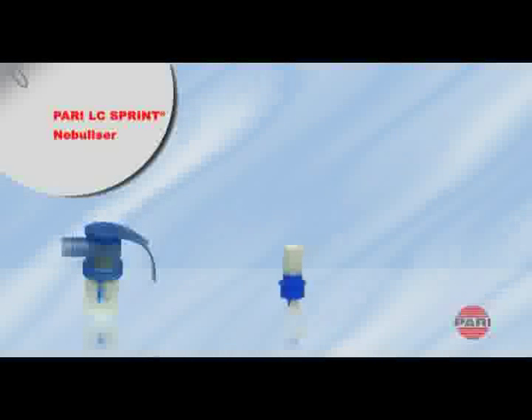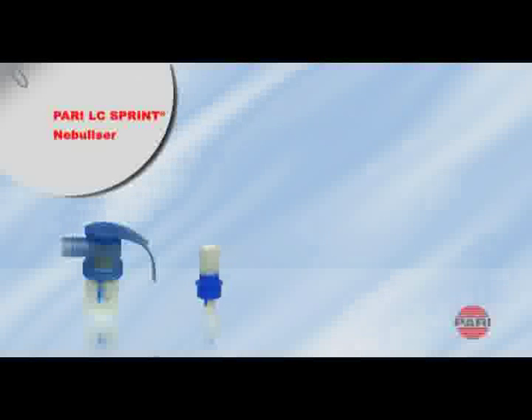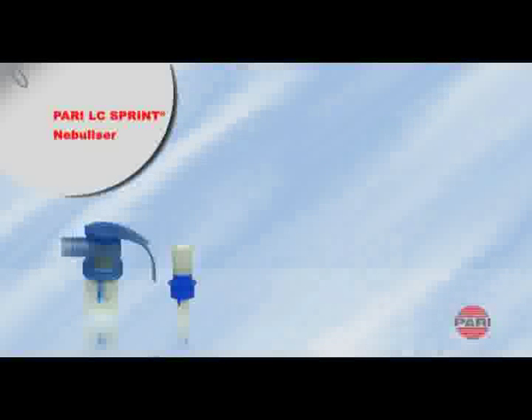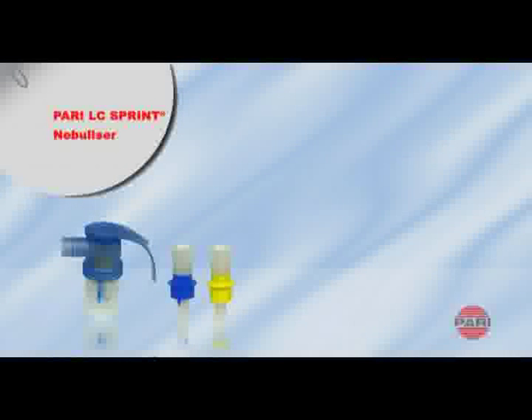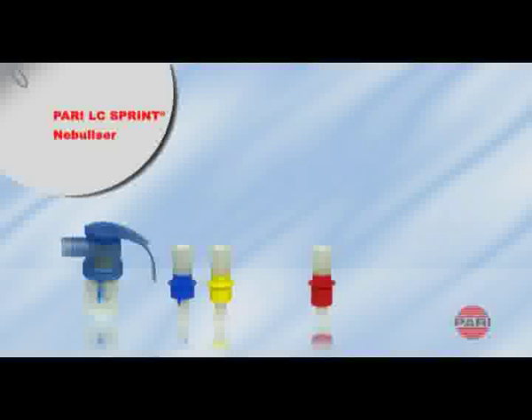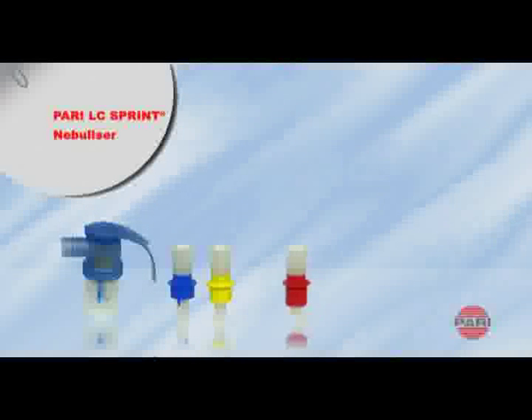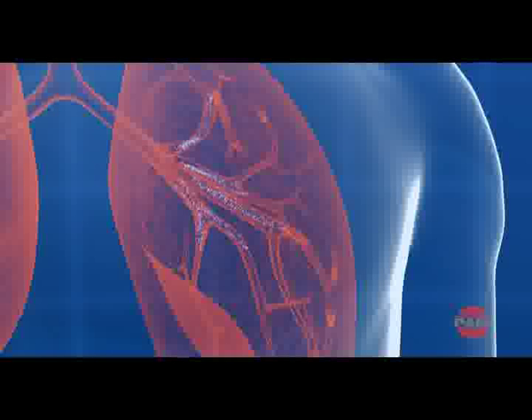The blue nozzle attachment is especially suitable for targeting the middle of the lung in patients from around the age of four years and upwards. The yellow attachment produces fine droplets for the narrow airways of babies and infants and forms part of the LC Sprint Junior nebulizer. The red attachment results in a very fine aerosol. This is ideal for treating the outer lung regions, as required for COPD for instance, or for the tiny structures of the lungs of newborn babies.